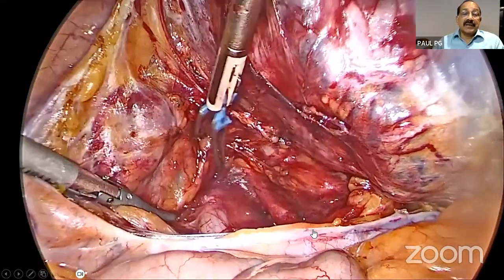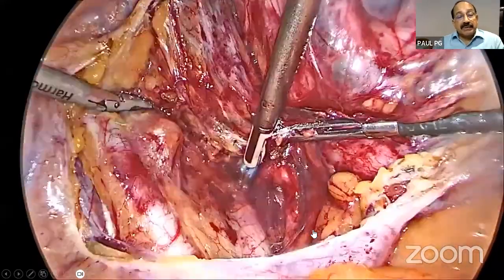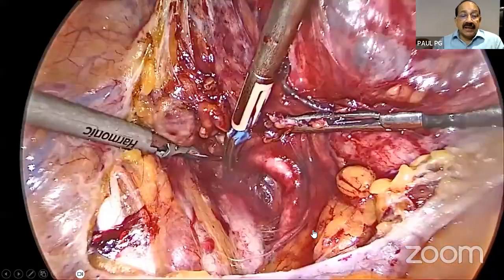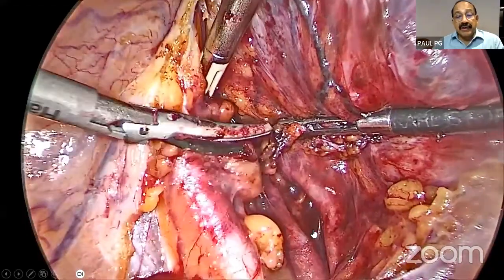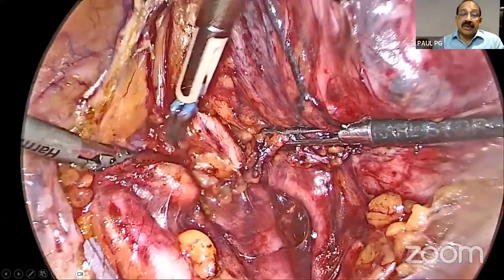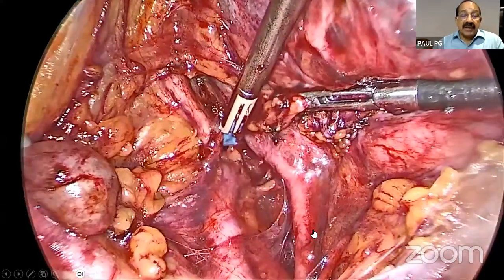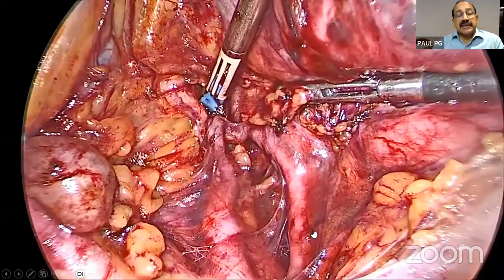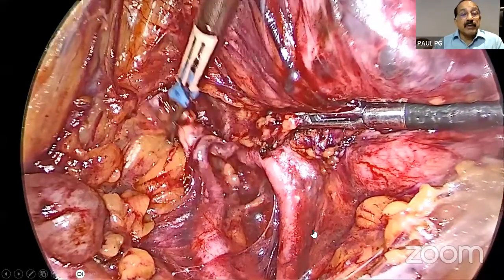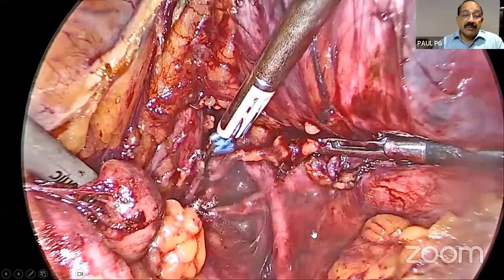This is very important, especially when you do a surgery like hysterectomy, or an adnexectomy, or when you remove the ovaries. You have to identify and isolate the ureter before you perform the adnexectomy, coagulate and divide the infundibulopelvic ligament. Especially in cases with residual ovarian cyst, remnant ovarian cyst, this is a must. You have to really isolate the ureter before you ligate.